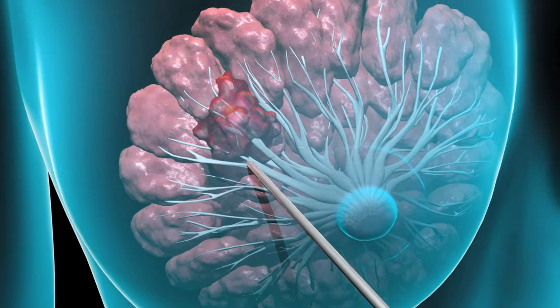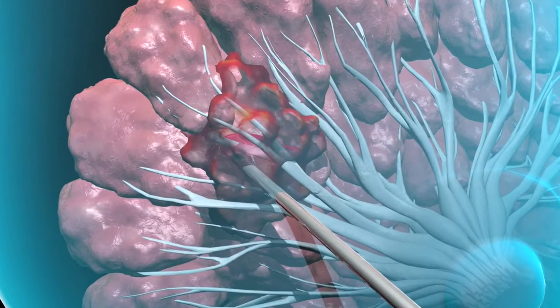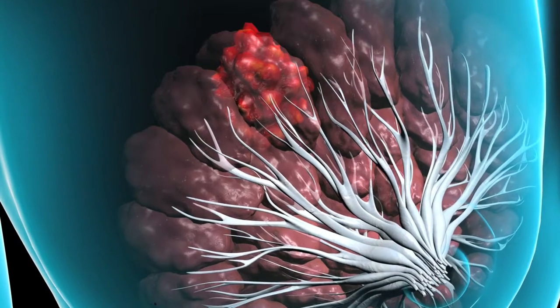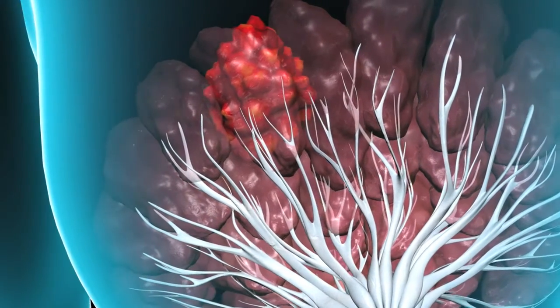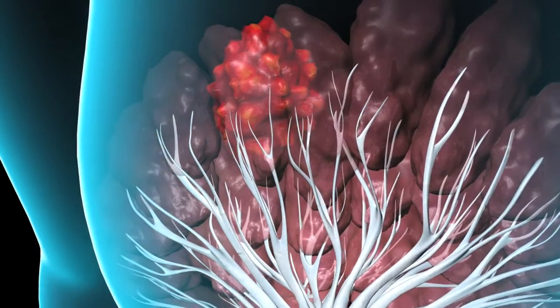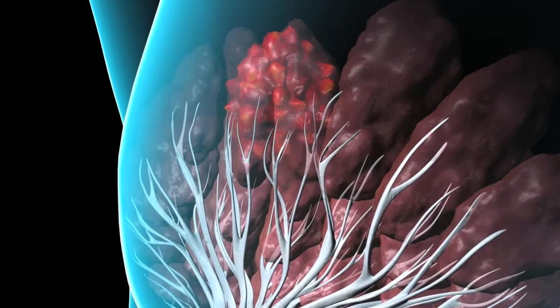In each procedure, a needle will be inserted into your breast to remove fluid or to sample the tissue. If your breast lump cannot be felt and is seen only on mammogram or ultrasound, your physician may recommend a stereotactic core or ultrasound-guided core biopsy.